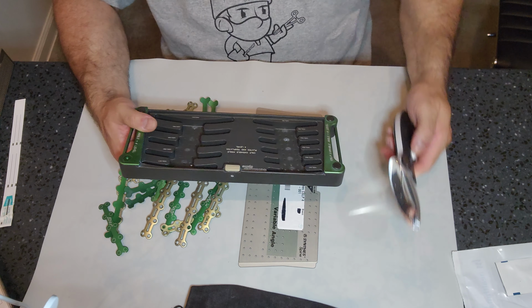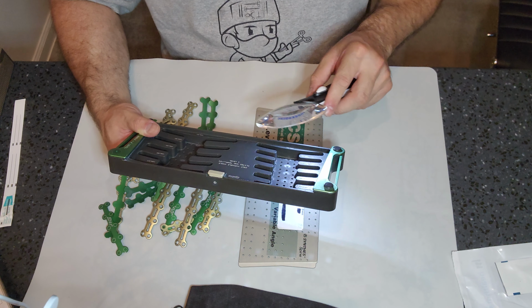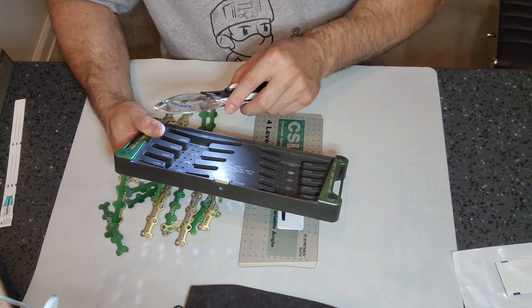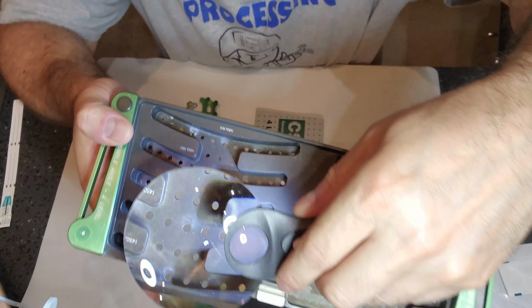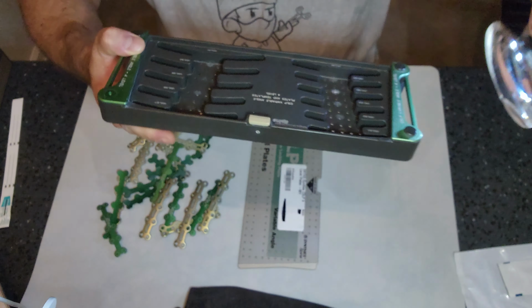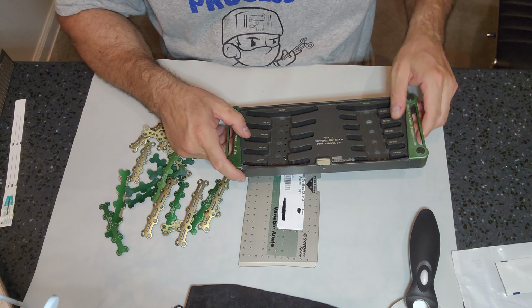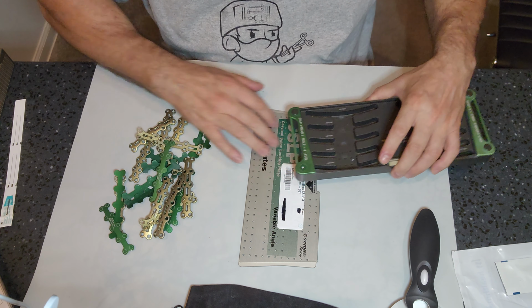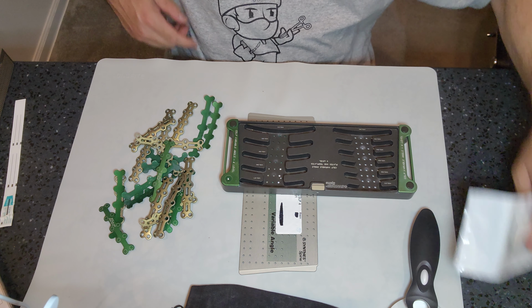But you want to go ahead and get your lighted magnification and inspect your tray for cleanliness. And check it out, guys. I see a little spot here. Okay, I hope you can see that. See that little white spot right there? Okay, that looks suspicious to me, right? I don't see that anywhere else on this tray. Before I even get to my instrumentation, I don't know what that is.